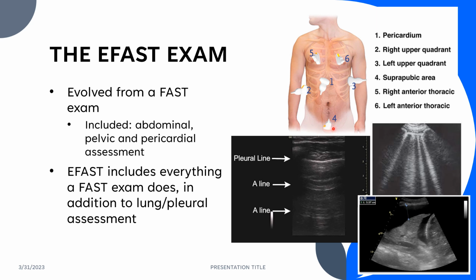Again, in our pelvic region, that vesicorectal interface is going to be the most dependent area in males. The pouch of Douglas or the uterine rectal interface would be the most dependent area in females. So right here, you'd be able to pick up any fluid collections. Just one quick note, if a female has recently ovulated, it's not abnormal to see some free fluid in that posterior cul-de-sac by ultrasound, so take that into consideration with your scanning.